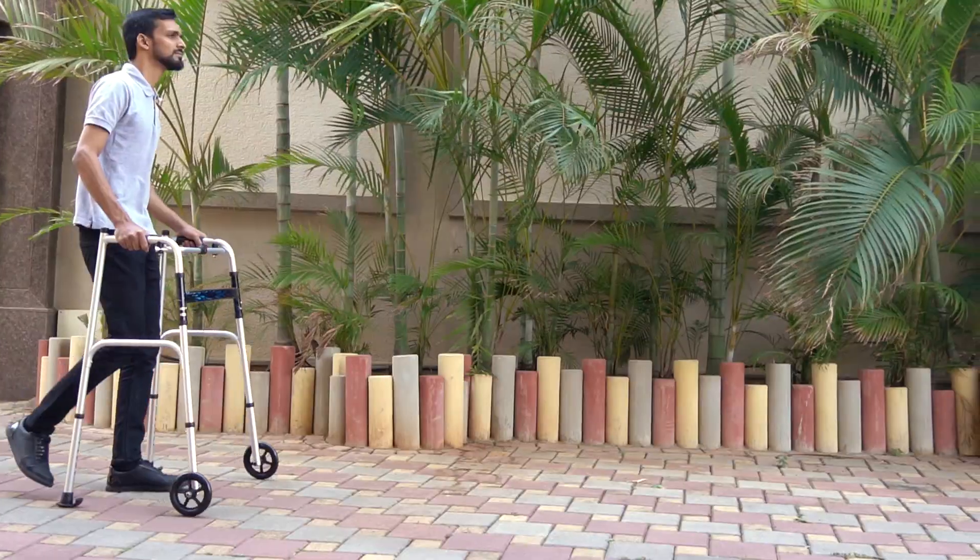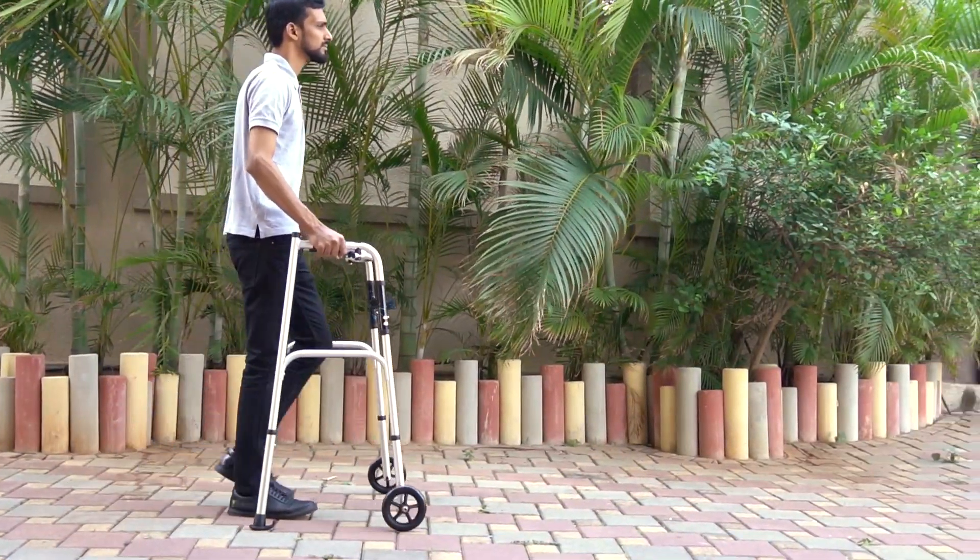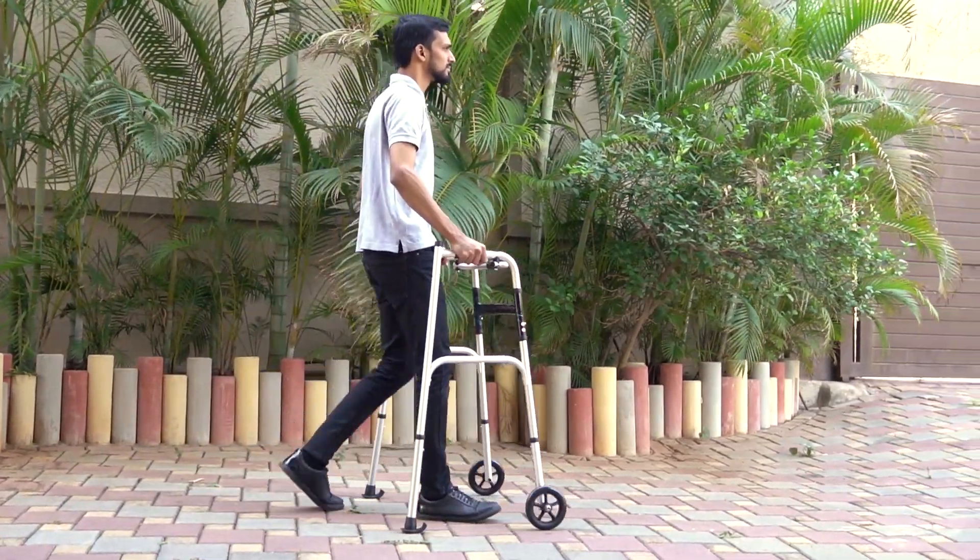With a simple detachment, it transforms into a traditional Walker, providing versatility for users based on their needs and preferences.